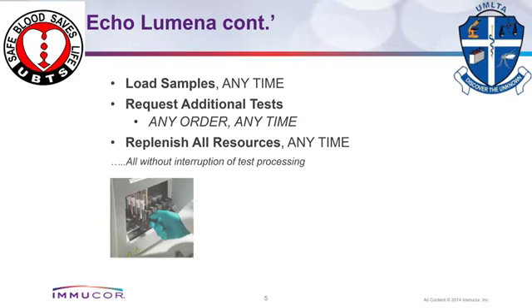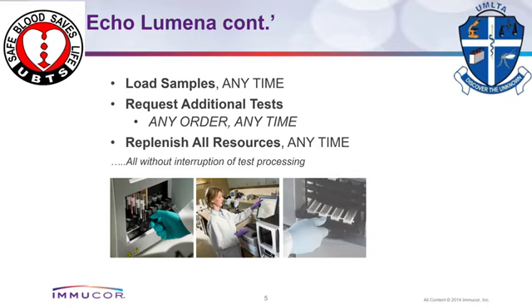Another thing is that this machine is able to load samples anytime. Anytime you request additional tests, it will keep on running. Now, I was not able to get a video, but when you look at this set here, in the middle, the staff is trying to load the information of the procedures. Then these are the capture strips where the reactions take place. They're also loaded in the machine. And here is the loading of the reagents. And that is part of the procedure when you are handling this machine.